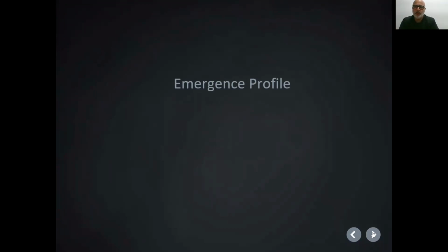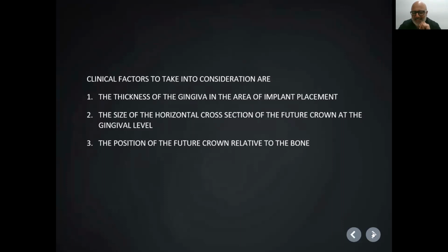So you've got this sort of lollipop or sort of oak tree shape. You want it to gradually come up. So you've got this lovely sort of paddle shape. Okay. And that's basically what the emergence is in a really basic form. It's not particularly more complex than that, but we can get more complex.